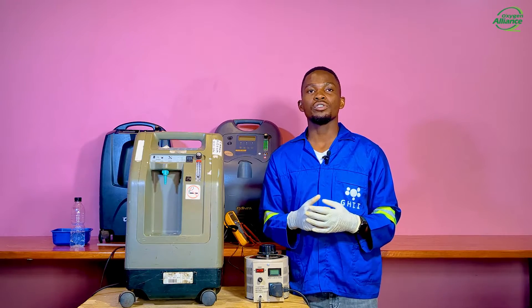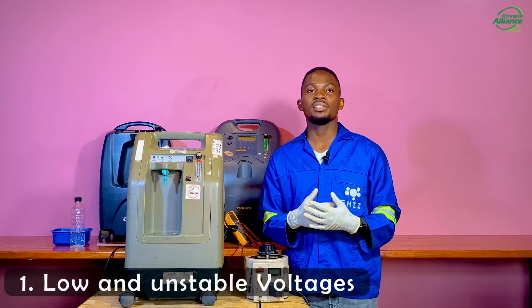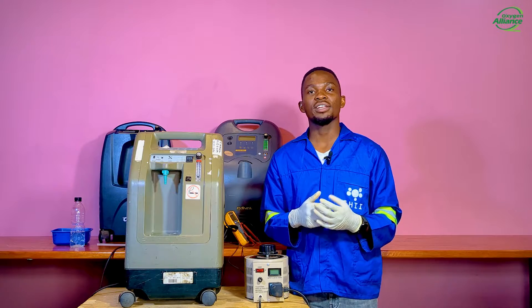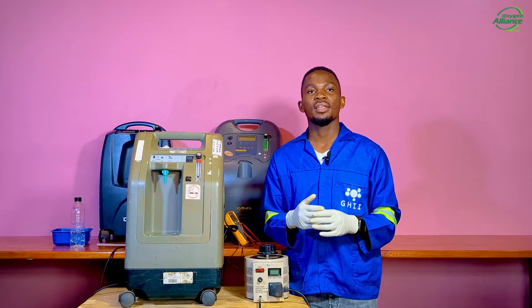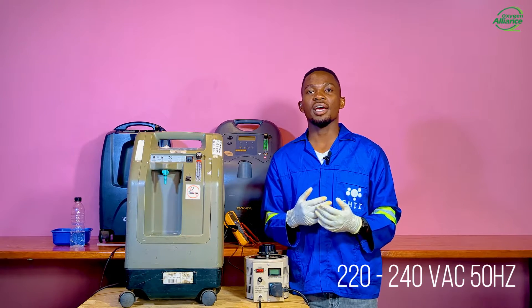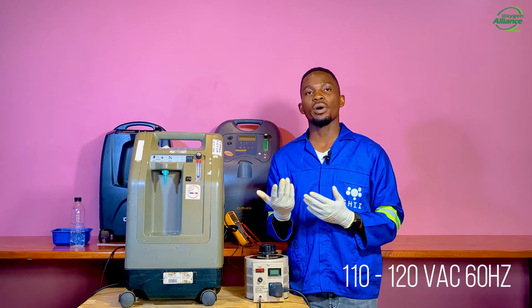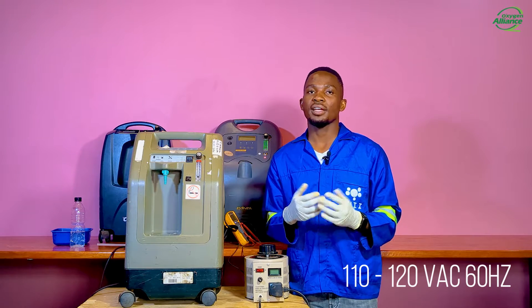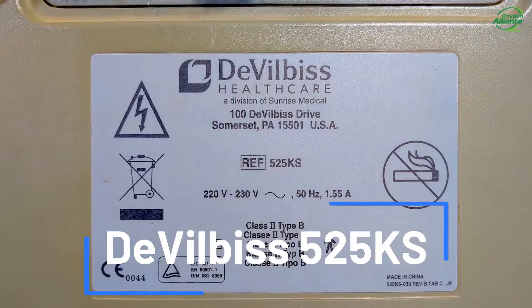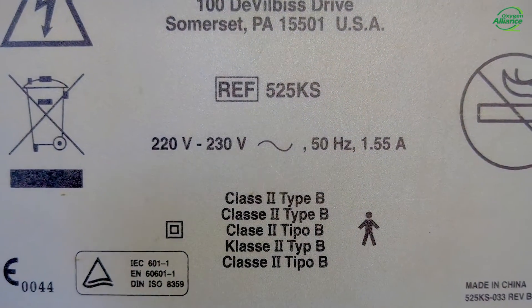The first cause of low oxygen purity in an oxygen concentrator that we will discuss today is low or unstable input voltages. Oxygen concentrators have a specified rated voltage that they can run on. The allowable voltage range is usually 220 volts to 240 volts AC at 50 Hz, but in other models it is 110 volts to 120 volts AC at 60 Hz. Our model today is the DeVilbiss 525, which has a rated voltage of 220 volts AC at 50 Hz.